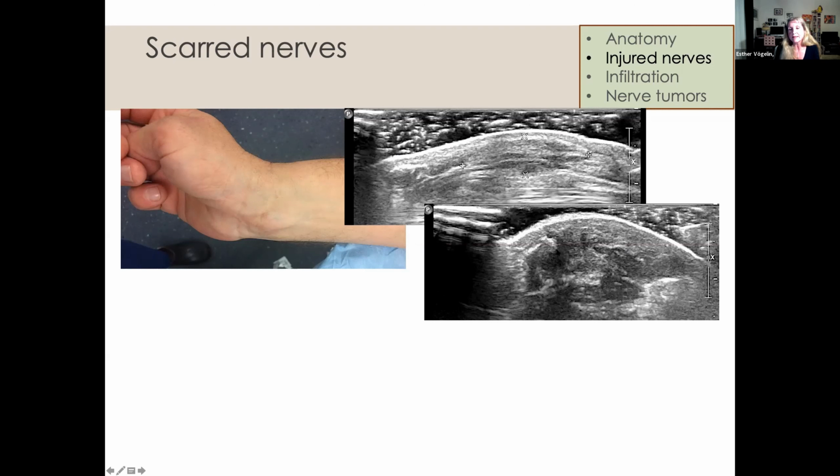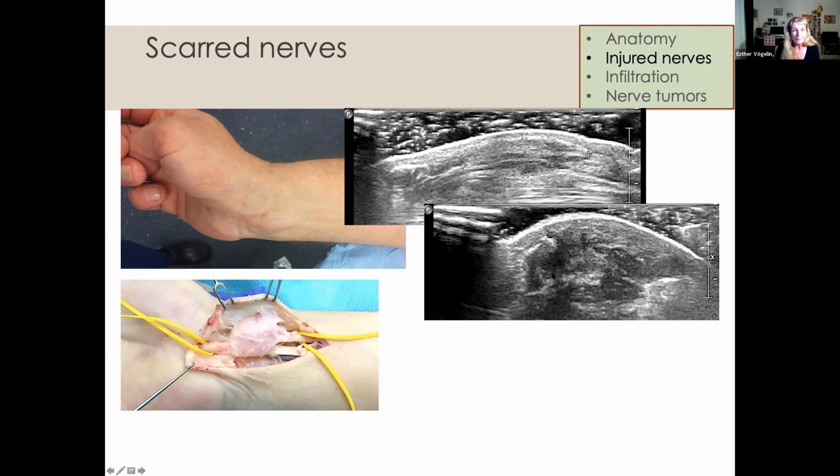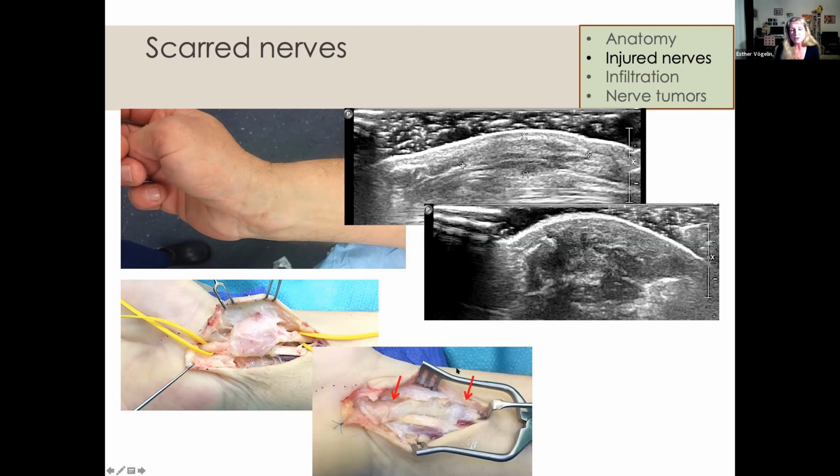You might see it's like an explosion. There is not much left of a salami slice in this area, but a lot of scars. The surgery of this nerve showed this scar formation or this neuroma in continuity, median nerve proximally, median nerve distally. And we decided to reconstruct this nerve again with a nerve graft. Here you see it already covered by nerve protectors and tissue. I don't want to talk to you about the indication, just what the ultrasonography helps us here.